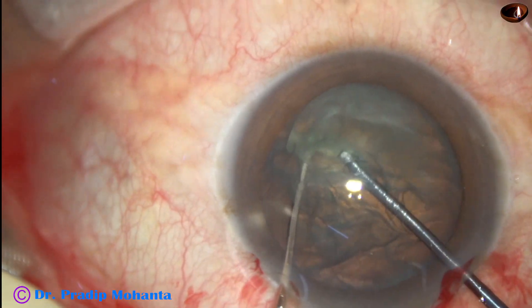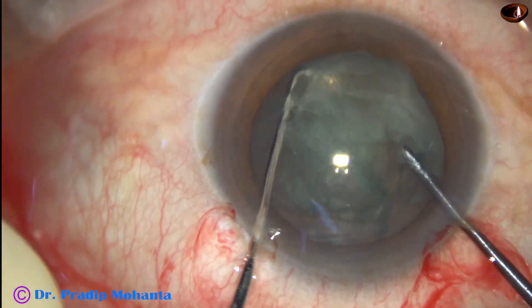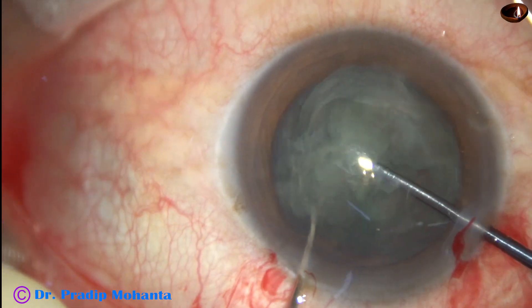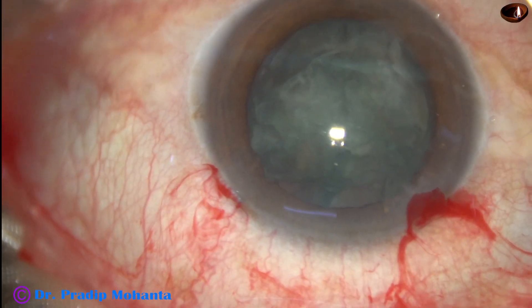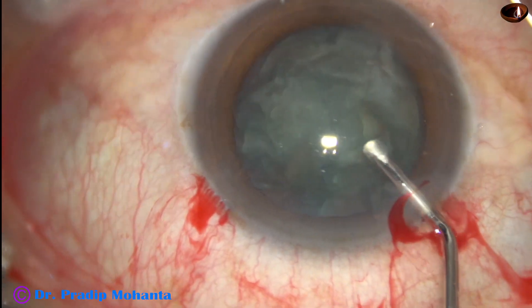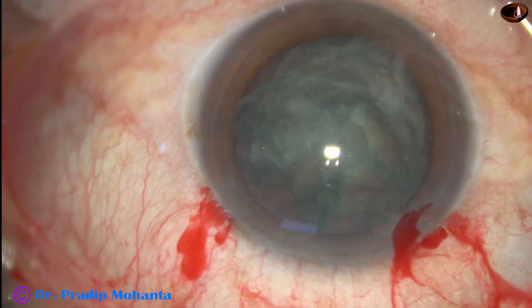This is Dr. Sohail's pre-chopper and it is being used to divide the nucleus into four pieces. In a few seconds we can do this. This is a real-time video, not edited at all.